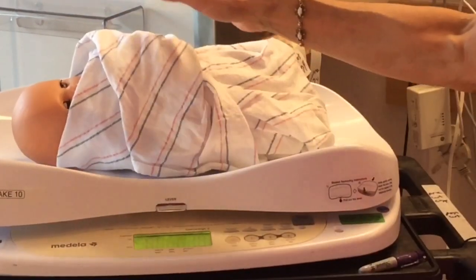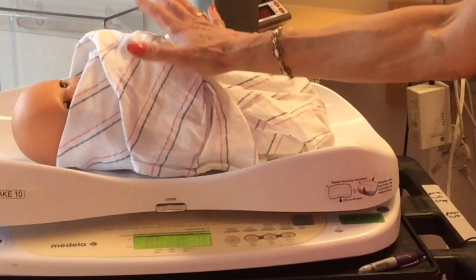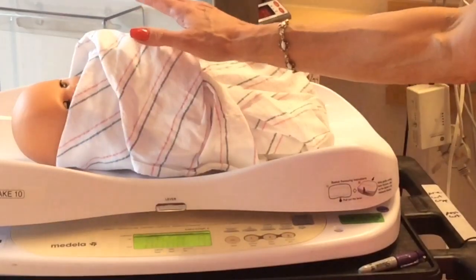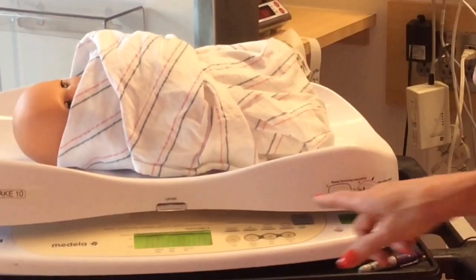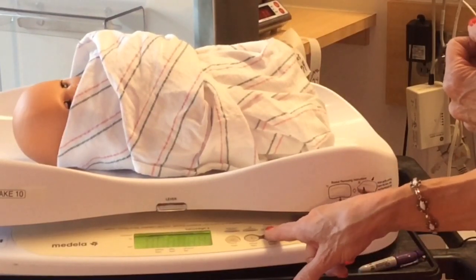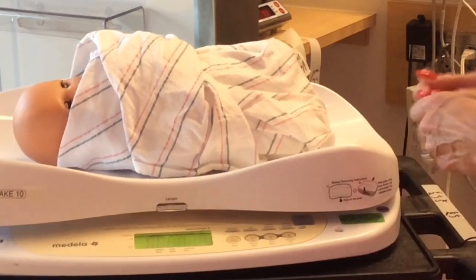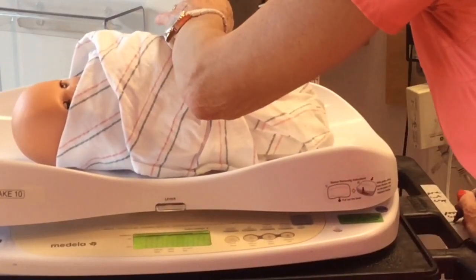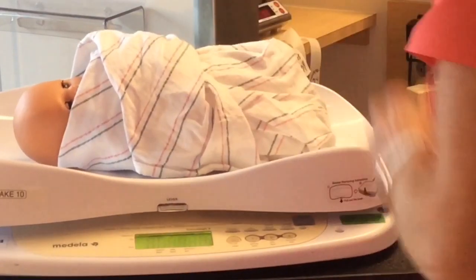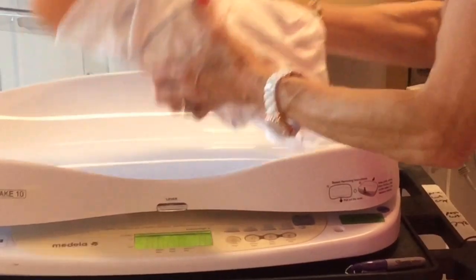Place the baby on the scale holding one hand over the baby. Wait until the display indicates lock and beeps. This value is the post-weight. Press 2. Record your weight. Remove the baby from the scale.